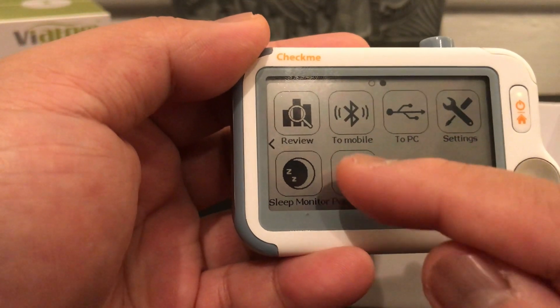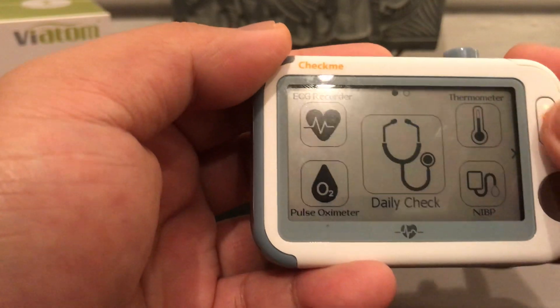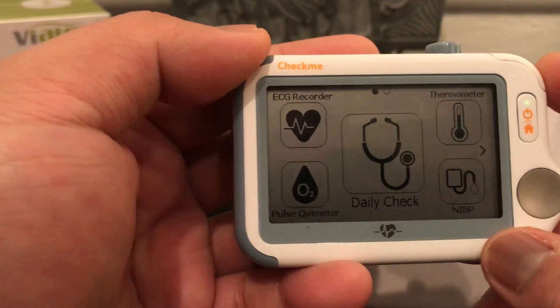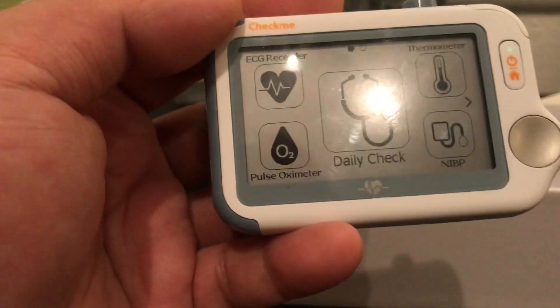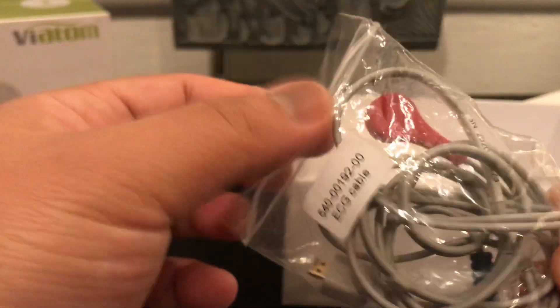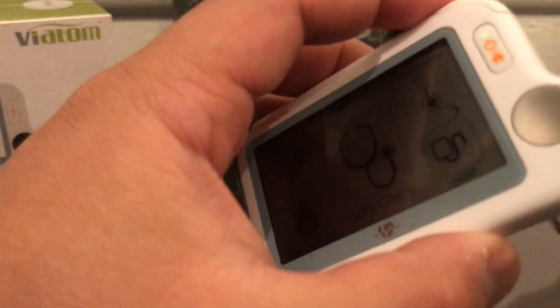Now let's use the ECG device with the external cables that came with it. Let's connect the ECG cables to the port, then attach the cables to the electrode pads.